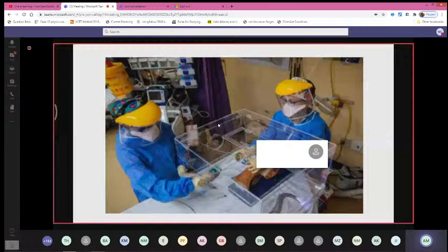An easy intubation can become difficult because the maneuvering is difficult, as you have to put your hands through the holes provided in the box, and you might not be able to secure the airway on time, and patients can go down drastically. Because of that disadvantage, they have become less popular, and I think nobody uses them now.